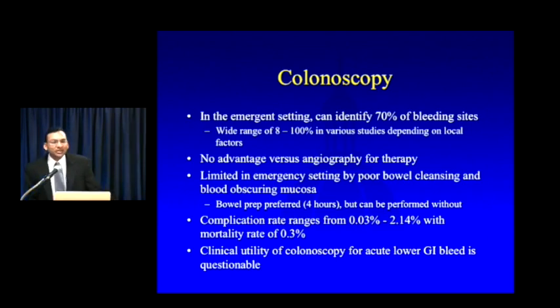The problem is that we're not talking about an outpatient setting when you're dealing with a patient who comes in with emergent lower GI bleeding. These patients haven't had a bowel prep, there's blood everywhere obscuring the mucosa, very difficult to figure out where the bleeding is coming from.